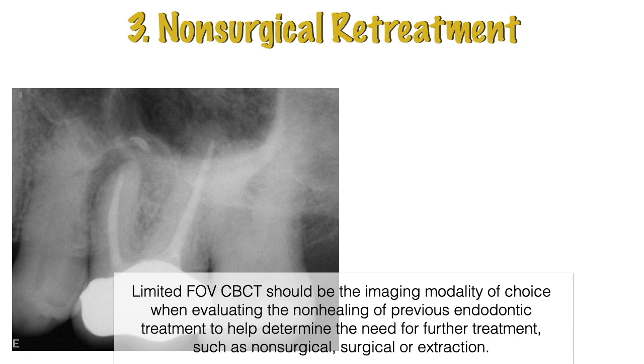Of course, clinicians will have to use their clinical judgment. These are guidelines. If you're looking at a tooth that has a very good root canal treatment and it's failing, you don't know why it's failing, a CBCT is warranted for sure. But if you're looking at a tooth that has a very poorly done root canal treatment, where the person who did it previously didn't do a very good job at cleaning and shaping, the filling materials are short, or you don't see a dense mass of materials, most likely it's going to be easy to fix.